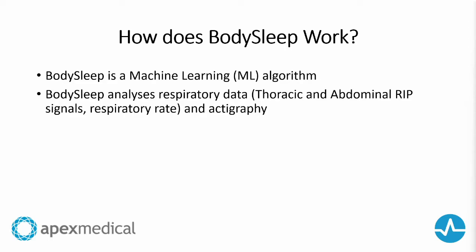So what BodySleep does is it analyzes respiratory data from the thoracic and abdominal respiratory inductance plethysmography bands, or RIP bands, and the respiratory rate derived from these RIP signals, and it also uses actigraphy to measure the impact of the brain state change on the body.